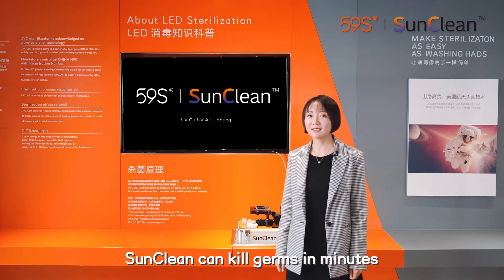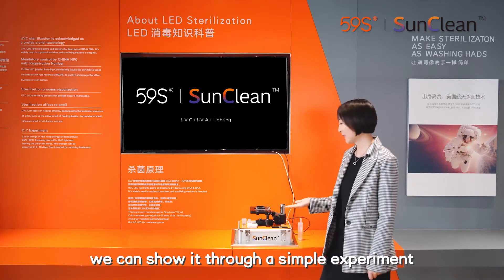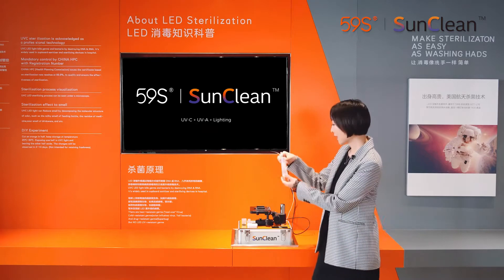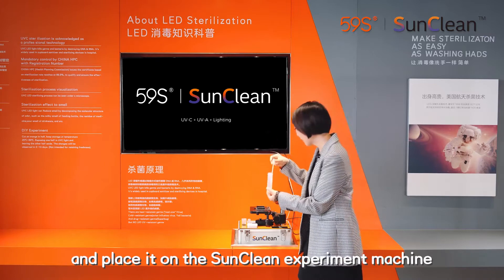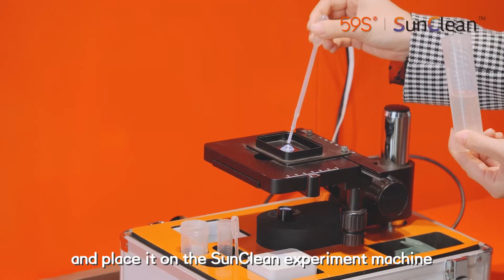SunClean can kill germs in minutes. We can show it through a simple experiment. This is liquid with a microbe. Take a drop and place it on the SunClean experiment machine.